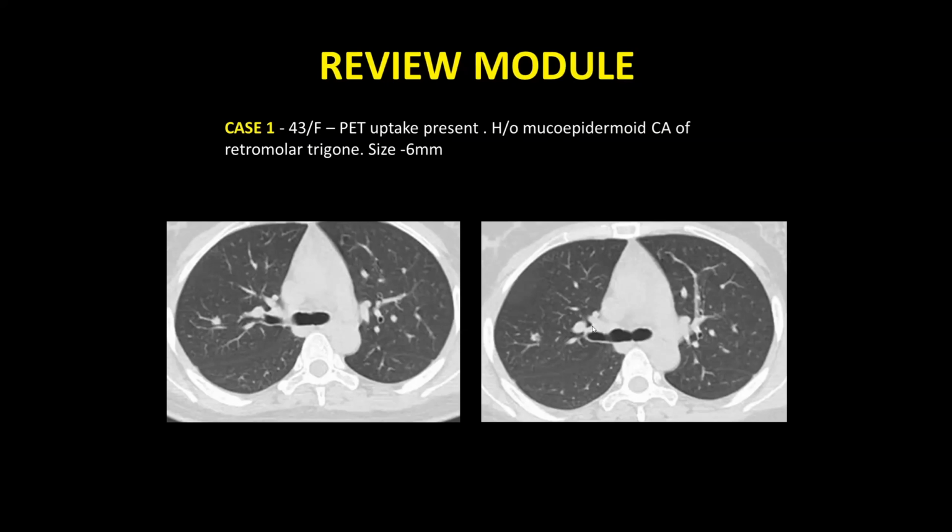Someone has written metastasis. Just put in your thoughts so we can discuss it. Synchronous tumor is another thought that is coming up. Okay, yes, the first thing that comes to mind is a metastasis. On 3-month and 6-month follow-up, it was stable, so it was not growing. There were no other features of metastasis anywhere else. So I think that makes it less likely.